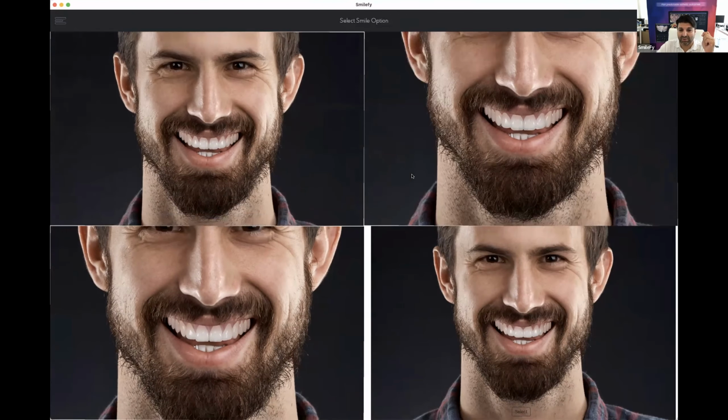Technology needs to help us create something like this in seconds. And I was focusing much more on the discussion with the patient to find out preferences, expectations, and so on. Because if we design half an hour a smile and the patient doesn't see himself in this new smile because the shapes are too round, closed embrasures, open embrasures, whatever it is, then we lose this time for nothing instead of finding out what the patient's expectations are.